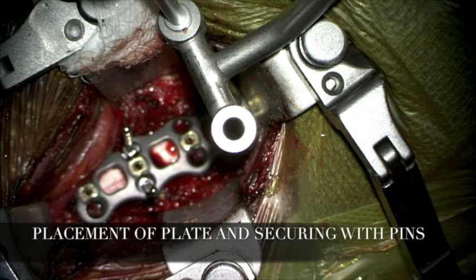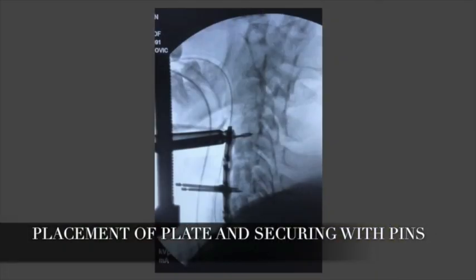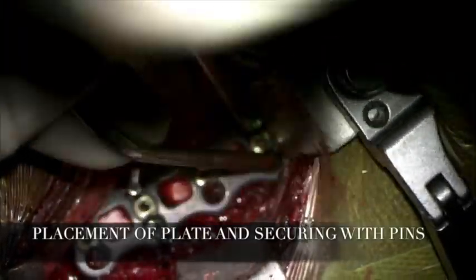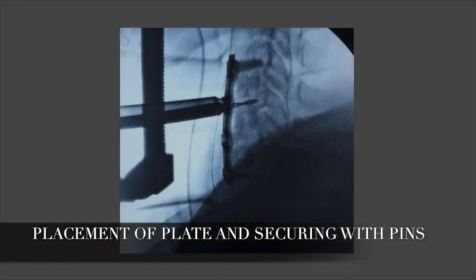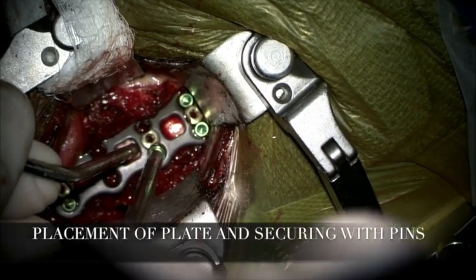The plate was secured to the vertebral body of C6 with pins. The drill was used to create a pathway for screws, and variable titanium screws were placed in position first at C4. The appropriate size of screws was chosen — 13 millimeters — as visualized on the lateral x-ray. We placed the screws into the vertebral body of C7 and then removed the safety pins. We repeated this process at C5 and C6 and confirmed with lateral x-ray.